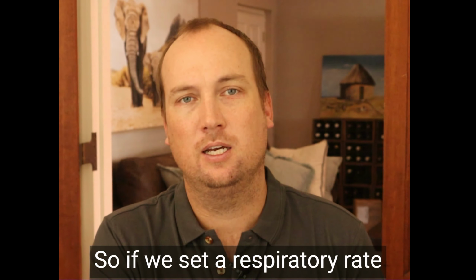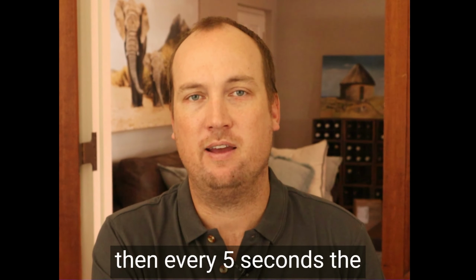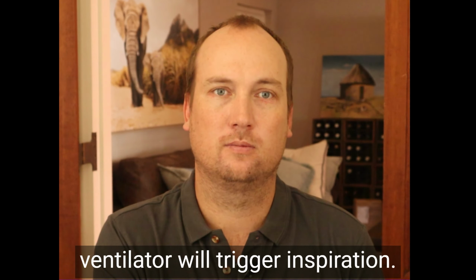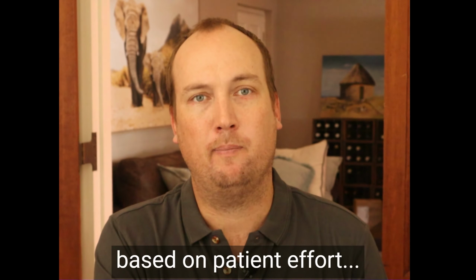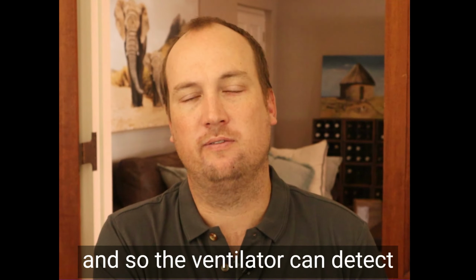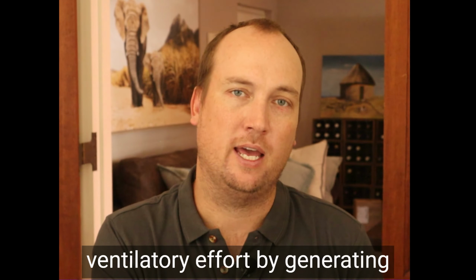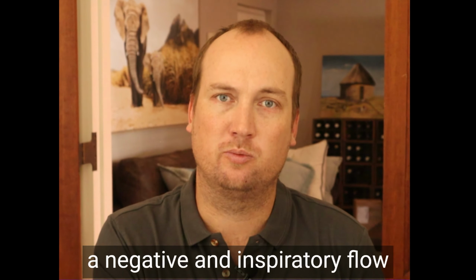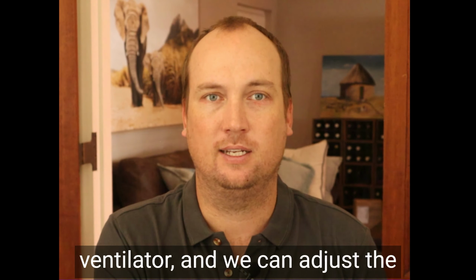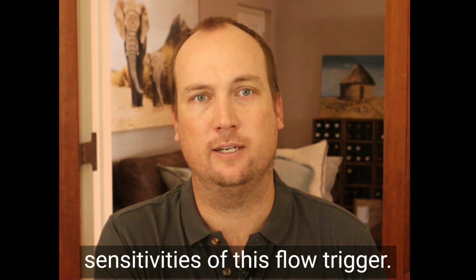So if we set a respiratory rate of 12 breaths every minute, then every 5 seconds the ventilator will trigger inspiration. The trigger can also be based on patient effort. This is usually inspiratory flow, and so the ventilator can detect when the patient makes a ventilatory effort by generating a negative inspiratory flow, and then a positive pressure breath can be triggered on the ventilator. And we can adjust the sensitivities of this flow trigger.